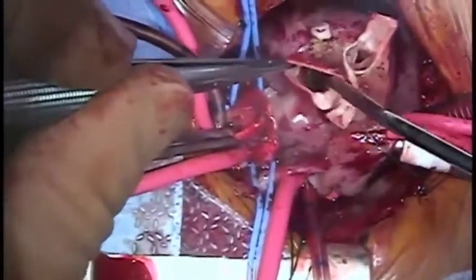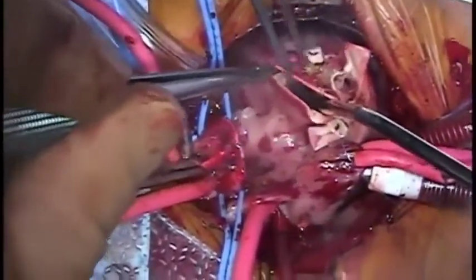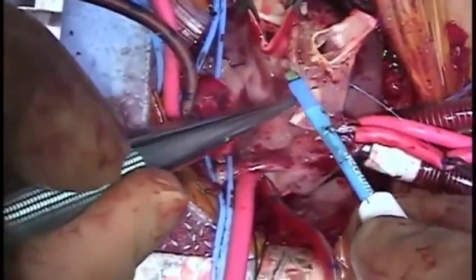The left ventricular outflow tract and pulmonary valve are inspected. The disproportion between the LV and RV outflows is particularly evident in this view. Further division of epicardium is carried out.